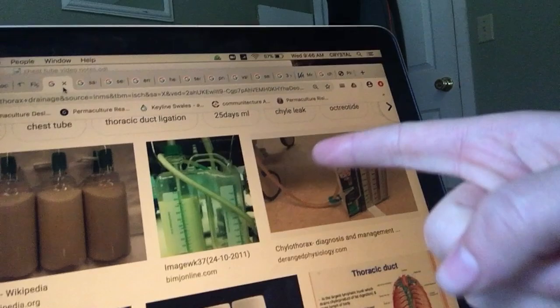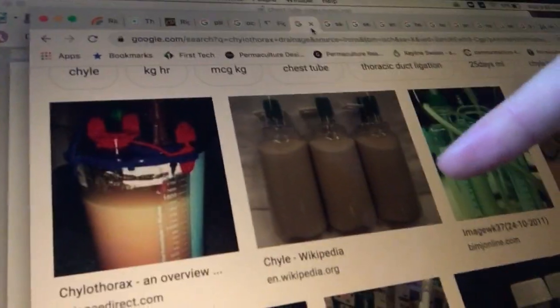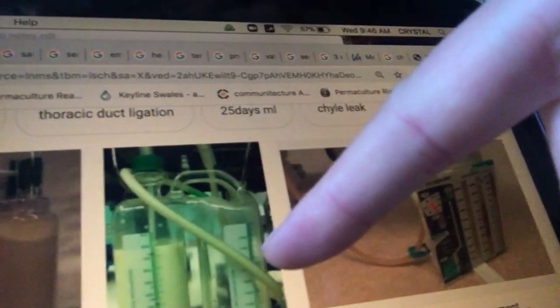This one is white, a weird whitish color. This is what you'll see if your patient has a chylothorax, which is lymph fluid. It really does look like milk coming out into their chest tube. It's also opaque and hard to see through. They'll be on some special diets if they have a chylothorax, because for some reason eating any kind of fat besides MCT oil causes this space to stay open and the lymph fluid to get in there. But that's rather unusual, and you can Google it and look it up. There's lots of information when you do that.